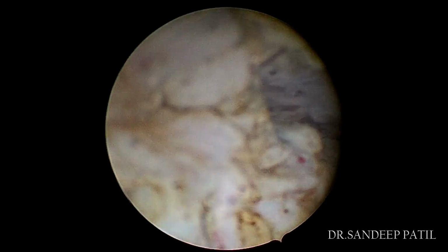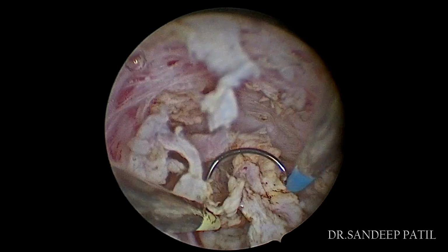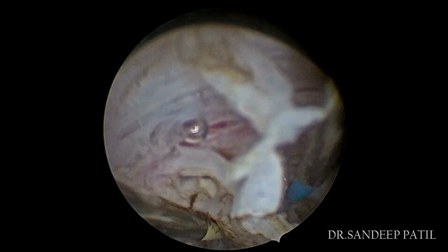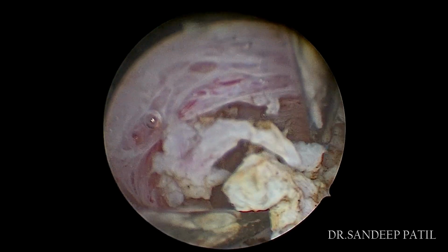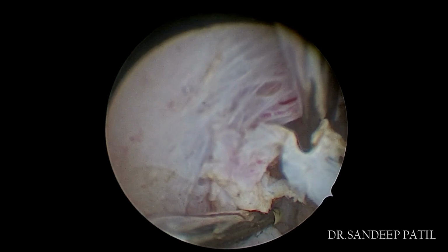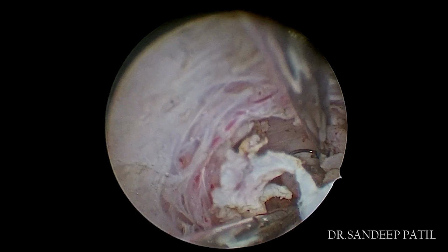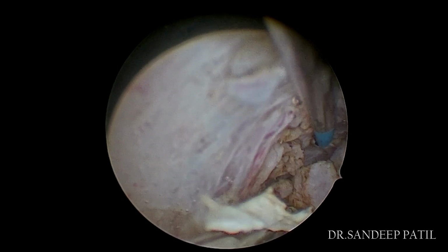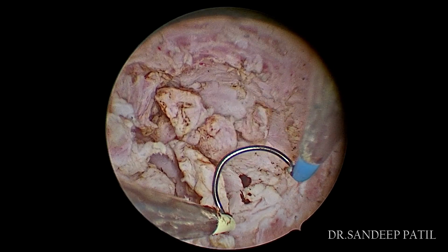its vascularity. We give post-operative estrogen therapy to promote endometrial healing, with progesterone for withdrawal for a couple of months, and then the patient is ready for further fertility treatment. In selected cases, second look hysteroscopy is performed after 3 months to assess cavity restoration and to detect adhesions.